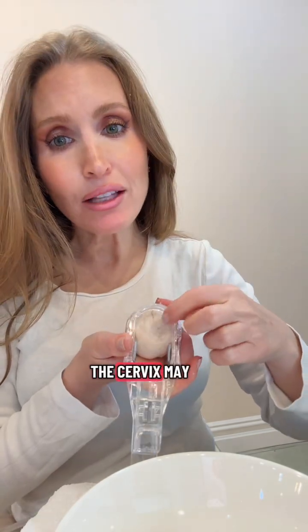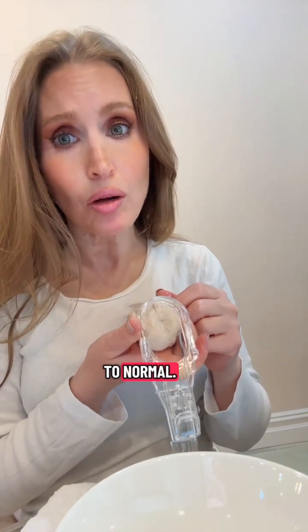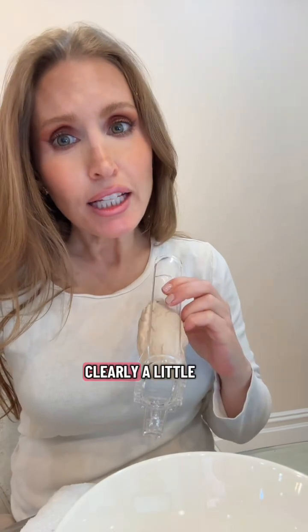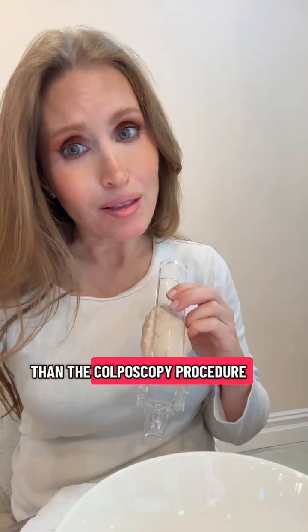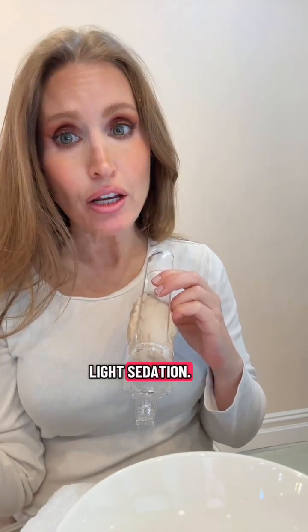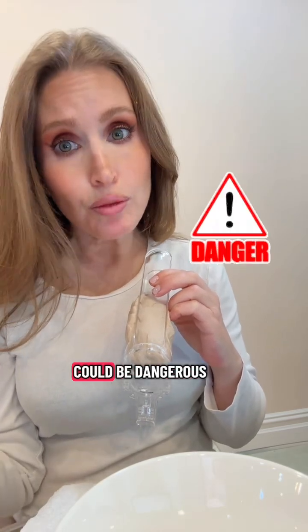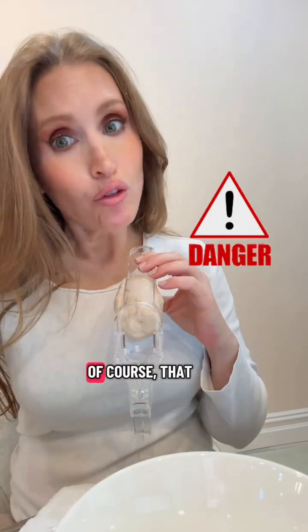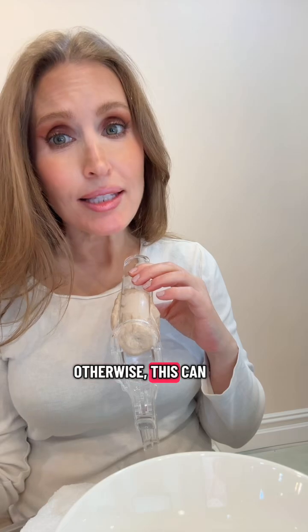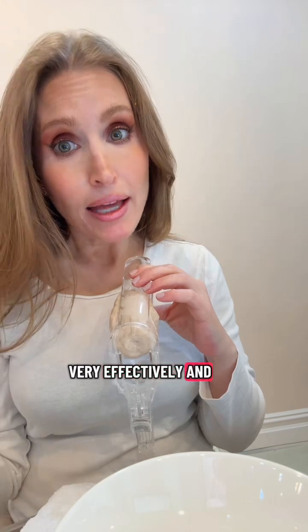The cervix may look a little funny for a little while, but eventually it does go back to normal. Now this procedure, the LEEP, is clearly a little bit more invasive than the colposcopy procedure. That's why doctors sometimes will offer general anesthesia or light sedation for certain patients very anxious about the pain involved in the procedure. It could be dangerous if the patient moves, and of course that isn't safe. Otherwise, this can be done in the office, again under local anesthesia, very effectively and with good pain management.